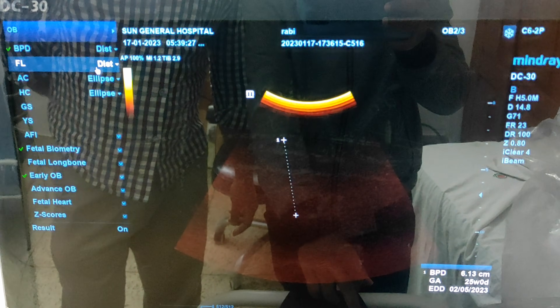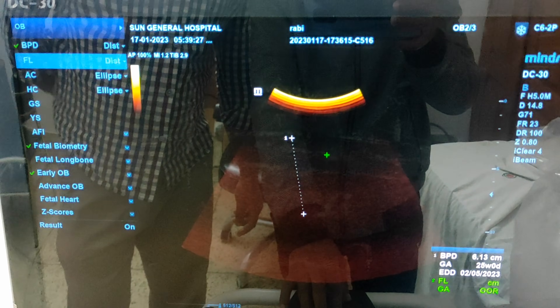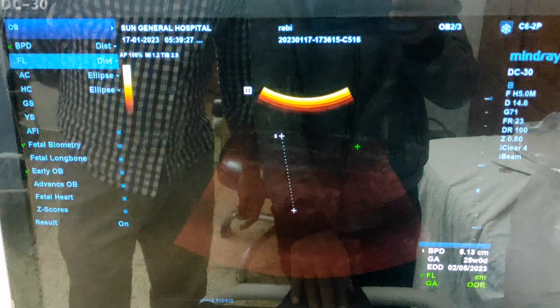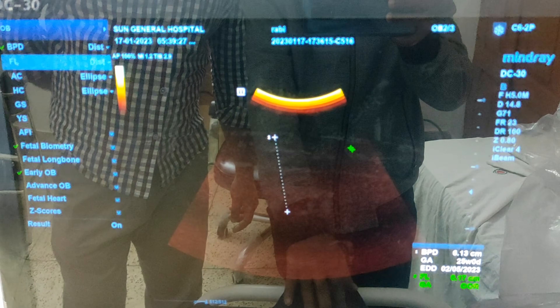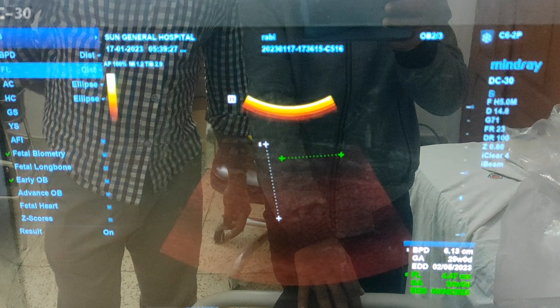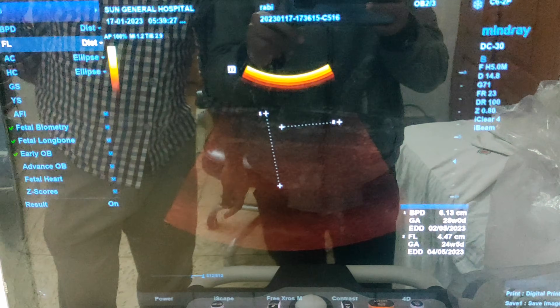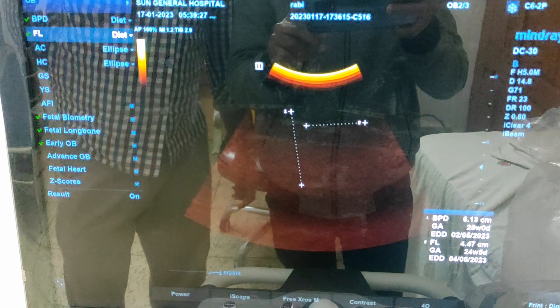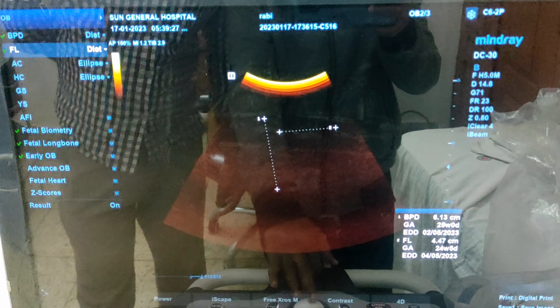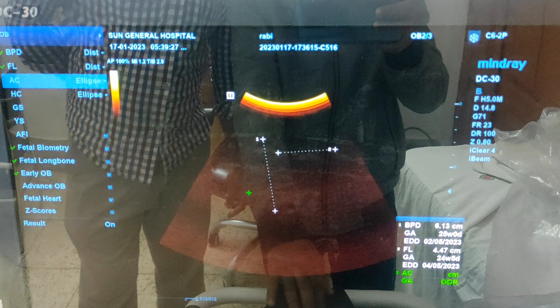Now I select FL, that means femoral length. Click one point here and another point here. Click your set button and the femoral length parameter will pop up in the lower right corner of the screen.